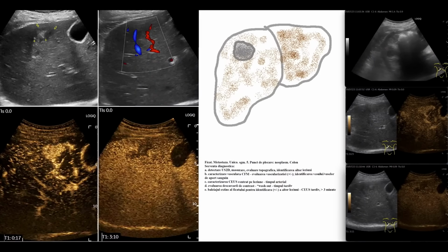Single liver metastasis located in the right hepatic lobe, segment V. This is a common situation: identification, detection of metastases in full organs, primarily the liver and peritoneum, of course, but primarily the liver, particularly when we have an already established diagnosis, endoscopically, colonoscopically, of colonic gastrointestinal tract neoplasia and with histological confirmation. In this situation, ultrasound is called for to identify metastases.